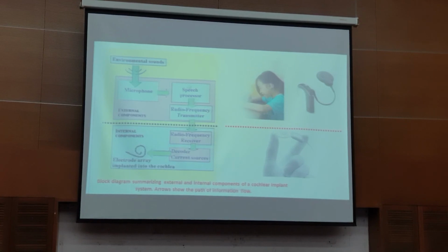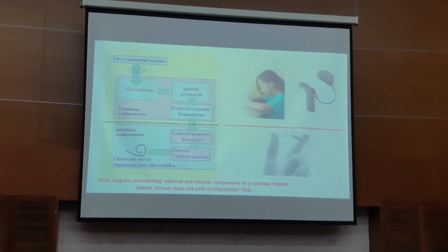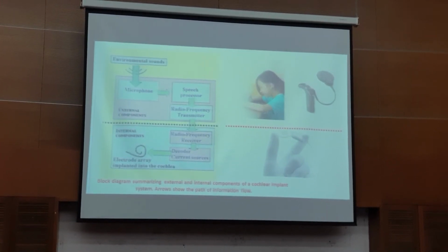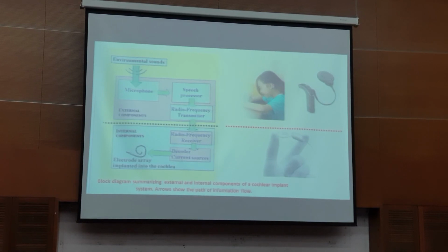For audiology I show you a little more, because you need to understand a little bit more of what is happening. For the rest of you, you probably didn't understand. From the speech processor, the coded signal is sent to the transmitting coil, and then passed through the skin using radio frequency. Radio frequency transmission to the inside.